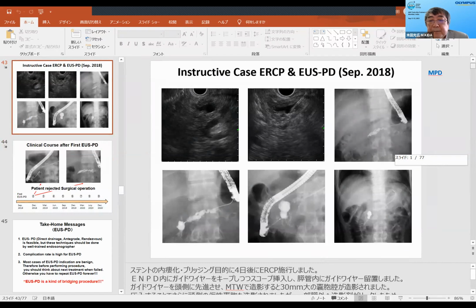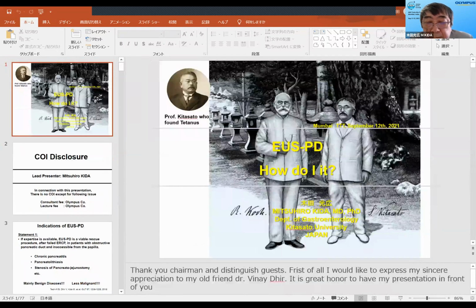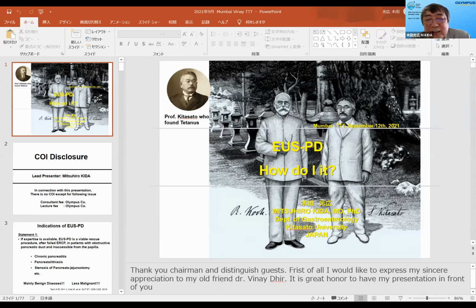Dr. Adil Ur Rahman is asking, what is your choice of dilator? Do you use a balloon or cautery dilator? At the moment, we employ the mechanical dilator named ES dilator. This is first. And secondly, nowadays we employ the REN balloon. This is also useful. Finally, after trying these dilators, we employ the Fine 025 electrocautery. This is our strategy.